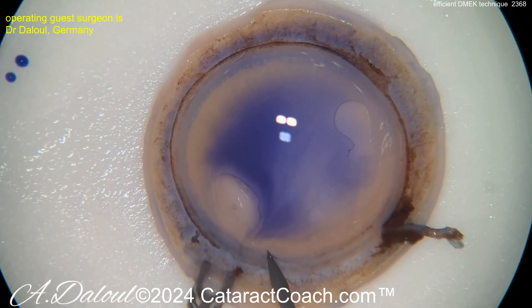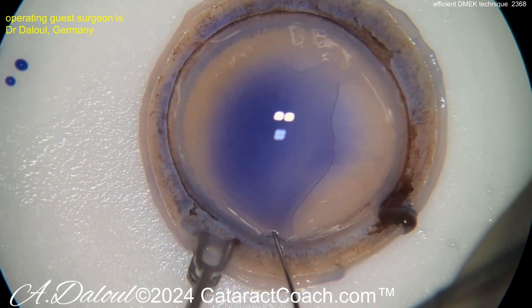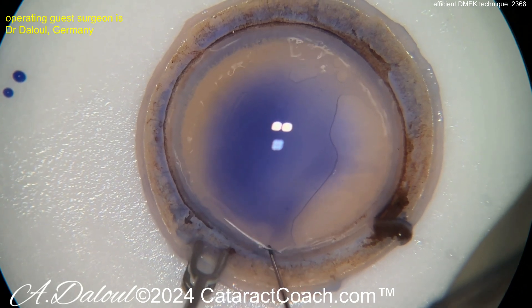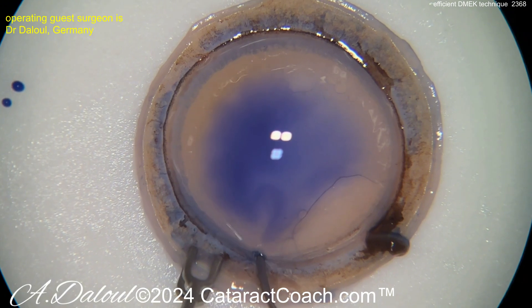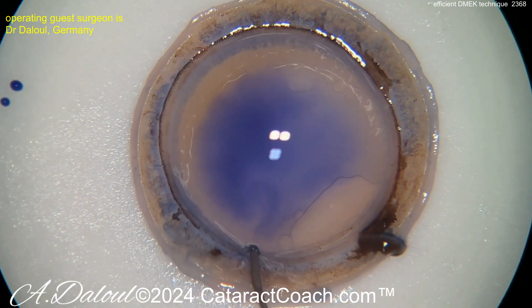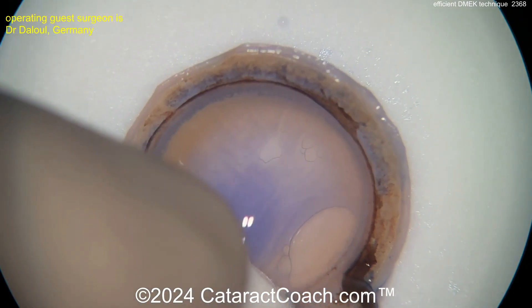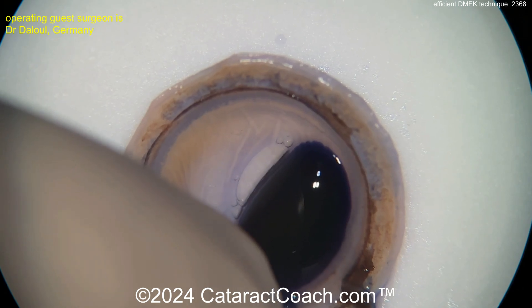Now in the USA we're very spoiled — we can actually get these tissues already pre-prepared. Not only cut to the right size and the correct thickness that you want, but you can also get them already stained with Trypan Blue Dye, already marked with a directional letter S so you can see if it's upside down or the correct way, and even already loaded into an injector. So we have a much easier technique here.